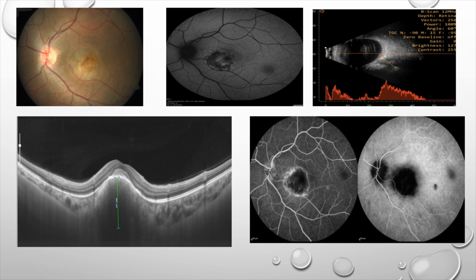The main problem is that the choroidal nevus and the small melanomas are very difficult to differentiate, and one probably may think that this can be a nevus, but a nevus transforming into a melanoma is also noted.